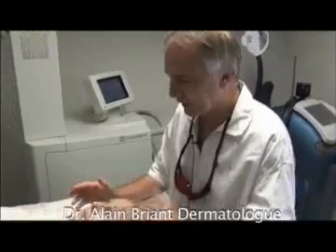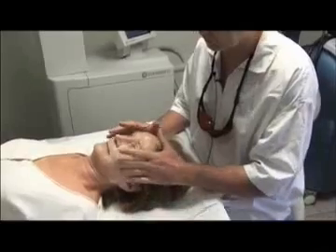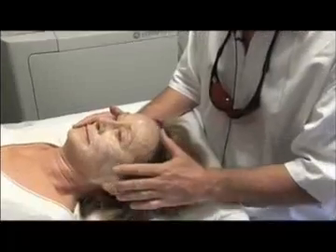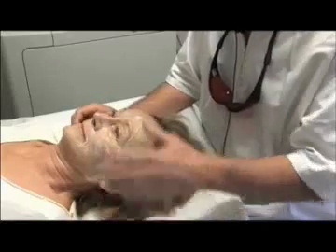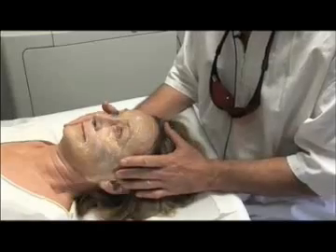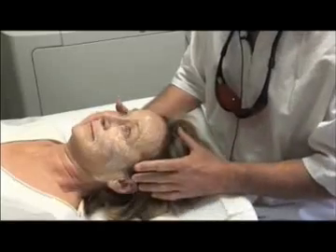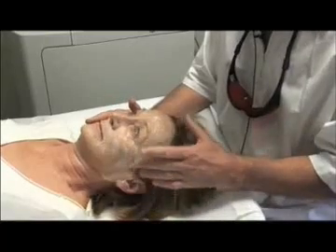As you can see, a contact anesthetic was applied using Anasterm. The cream was applied in 2 applications in a thick mask that is being absorbed progressively. The first application was performed 1 hour before the intervention with 3 full tubes in order to cover the face, and the second application was performed half an hour before the intervention, again with 3 full tubes on the whole face. The patient previously took Codolipran, 1 tablet before the intervention, in order to decrease the pain.